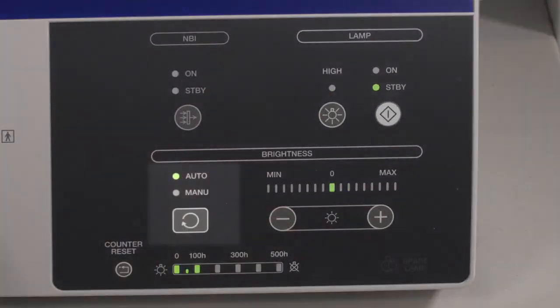The auto light function utilises communication between the processor and the light source to adjust light delivery according to the surgical site. That is, in the instance of flare or darkness, the processor communicates to the light source and light delivery is adjusted accordingly. This video has been slowed down to show how the processor and light source can communicate to adjust according to light requirements when set to auto. The actual adjustment happens so quickly it can't really be noticed by the system user.